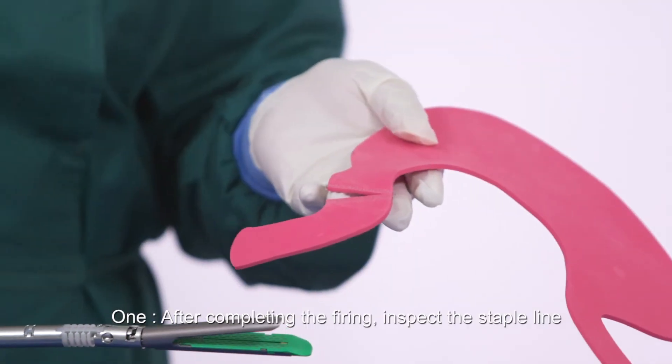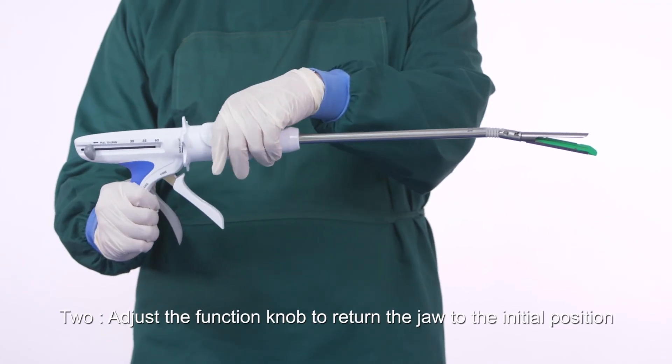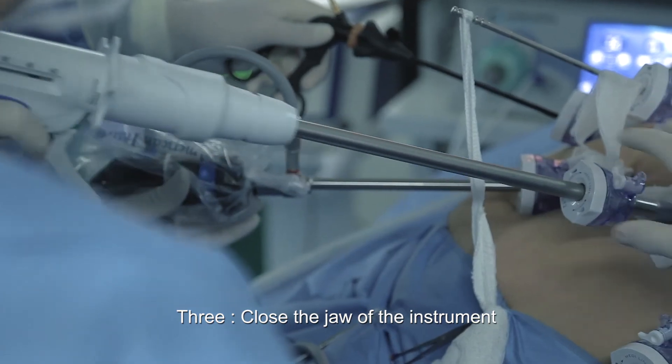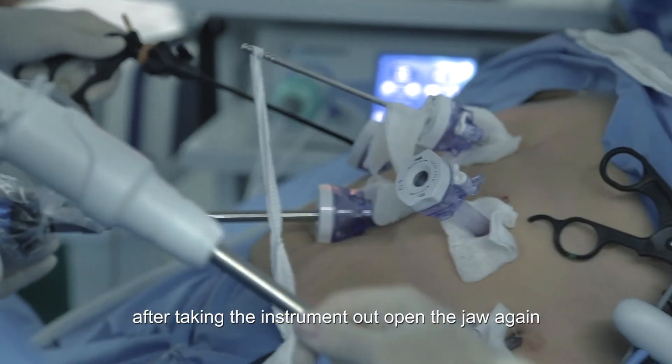Taking out the instrument and unloading the cartridge: after completing the firing, inspect the staple line. Adjust the function knob to return the jaw to the initial position, then close the jaw before taking the instrument out from the trocar. After taking the instrument out, open the jaw again.